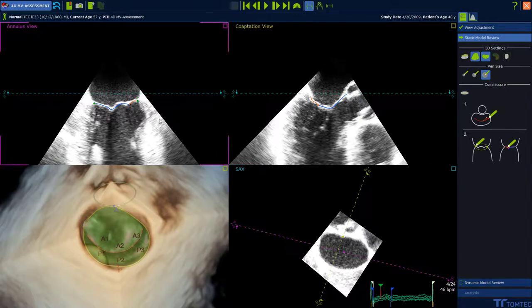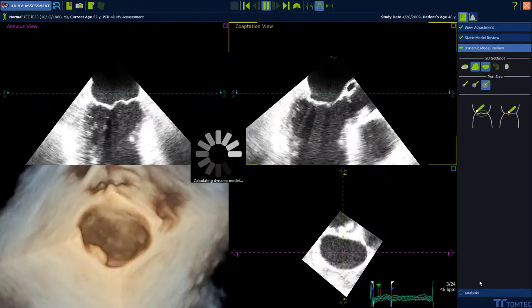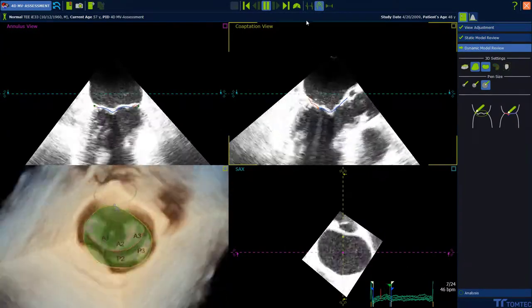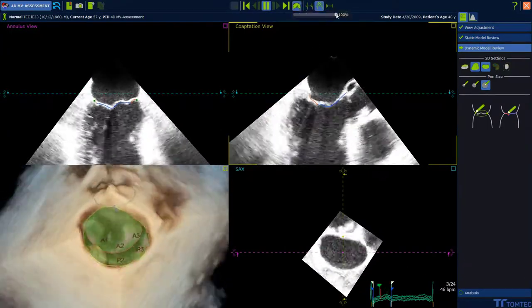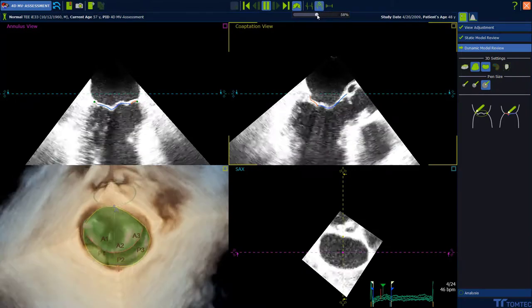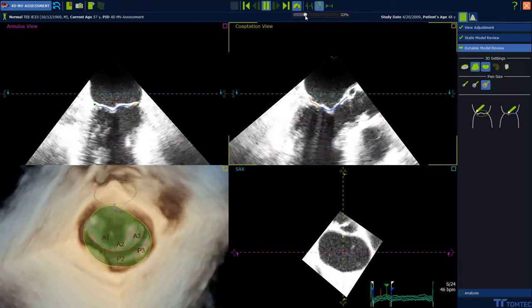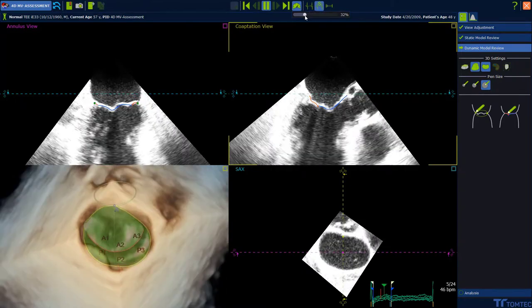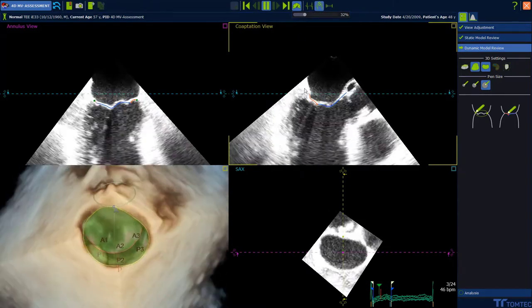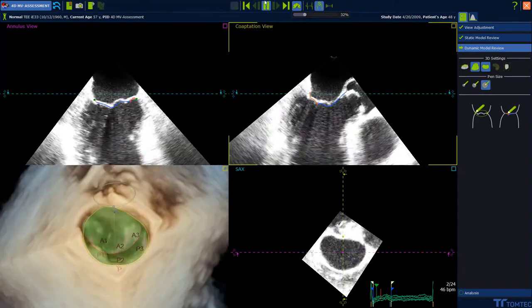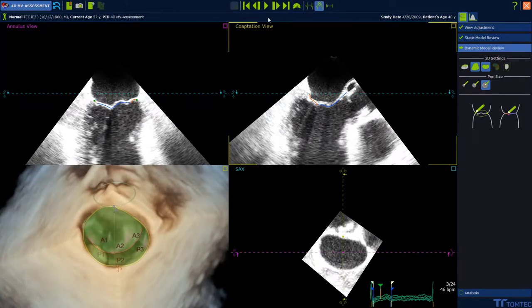Select dynamic model review to visualize a systolic dynamic model. To evaluate the tracking, reduce the velocity.